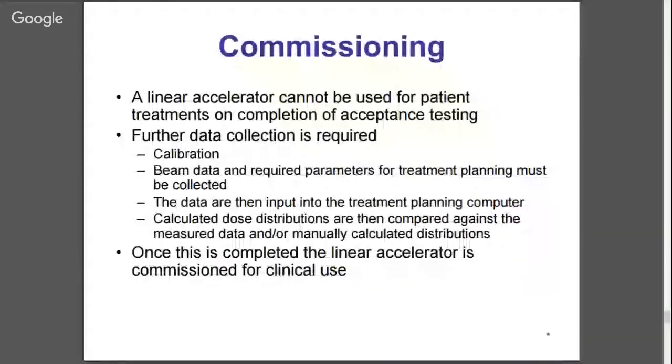Okay. And then once we've acquired all this data, we can do dose calculations within the treatment planning system in simple phantom geometries, and we can compare the measured and manually calculated distributions. And once we've been through all this process, the linear accelerator is considered commissioned for clinical use.